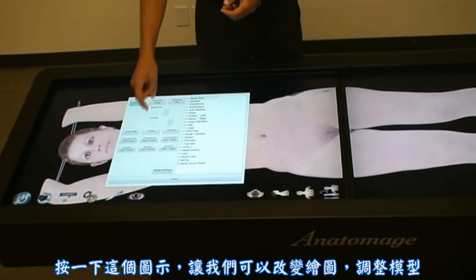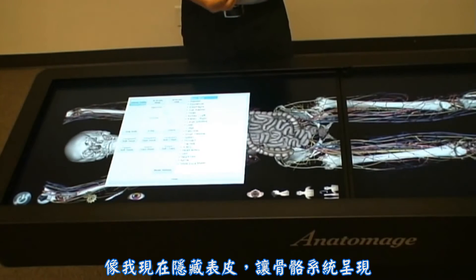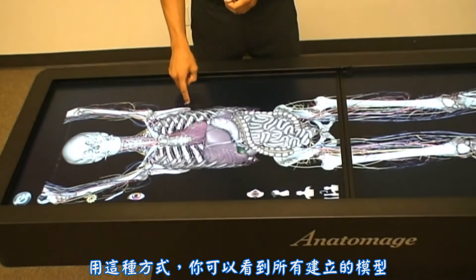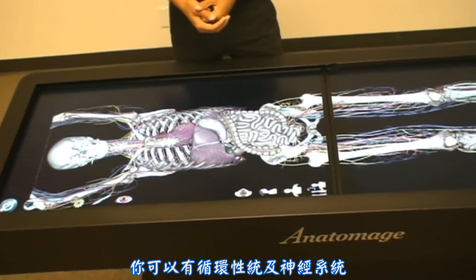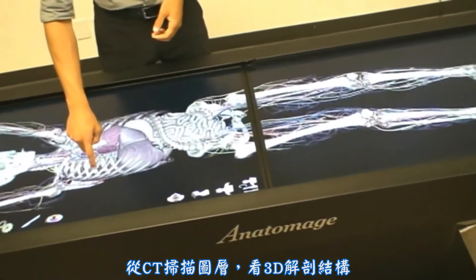Pressing this icon allows us to change our renderings and adjust the models independently. As I hide the skin, I have the skeletal system showing. You can see all the other models added here as well — we have the circulatory system, the nervous system, and the digestive organs, all modeled directly on top of the 3D anatomy from the medical CT scan data.